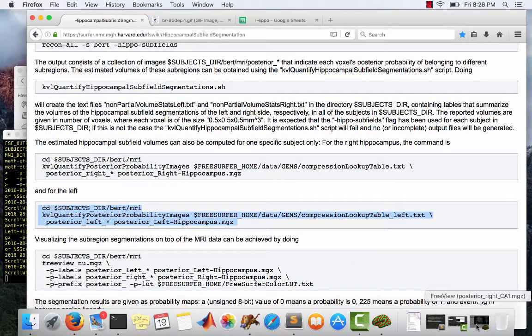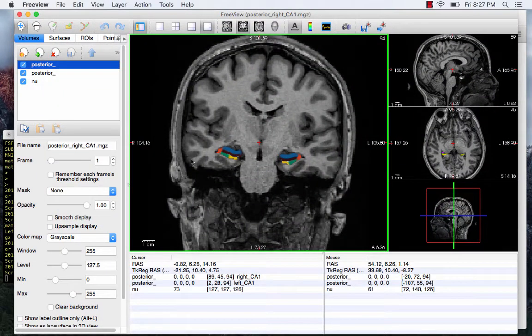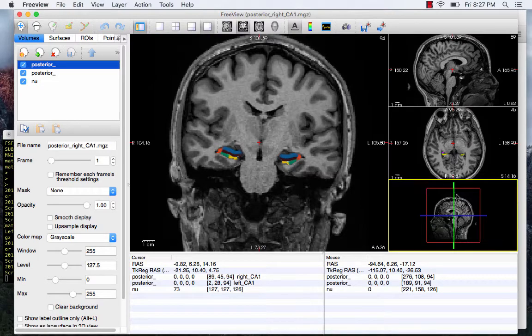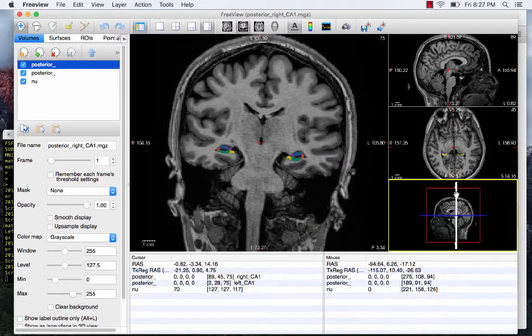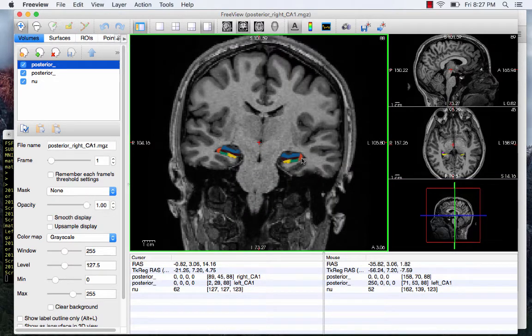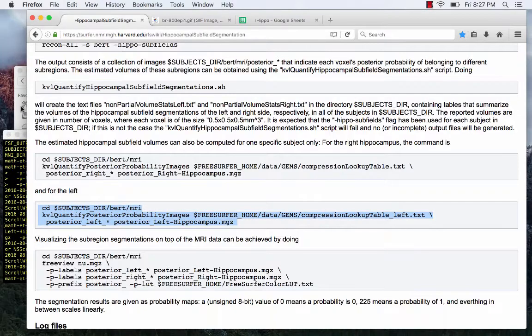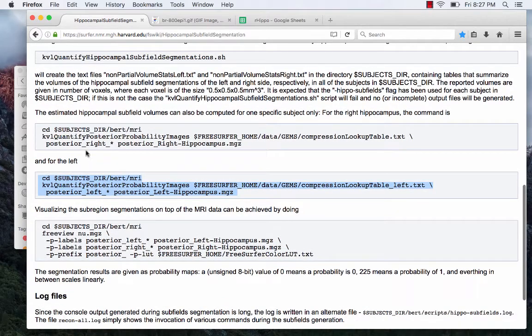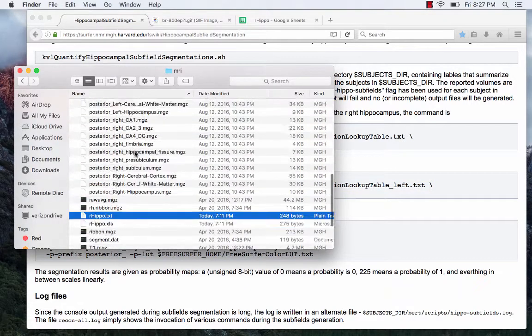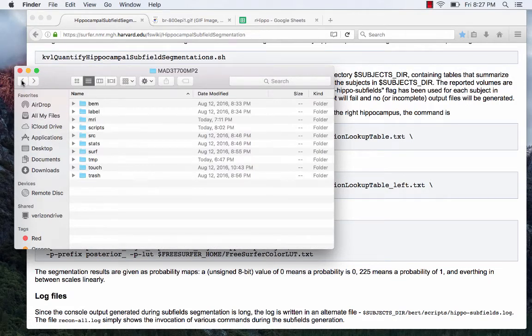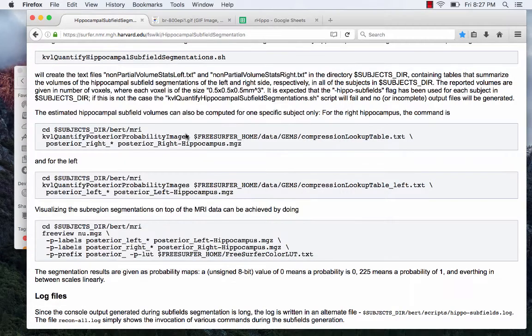If you wait fully for FreeView, it will look like this — you can see both left and right hippocampi overlaid. I check this to make sure it looks vaguely correct, and it looks pretty good. You can also use the volume measurements as a double-check for anything that looks weird. The second code option lets you run subjects individually, which is what I've been doing more of. Since my subjects folder basically just has my one brain in it, I could run either one.